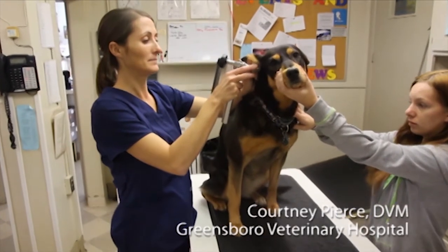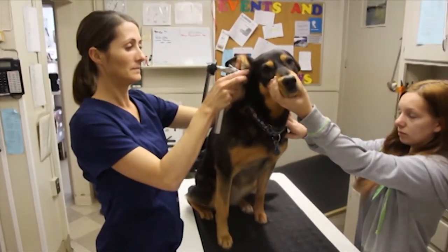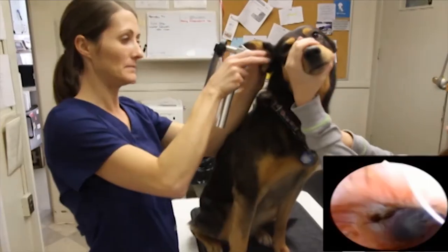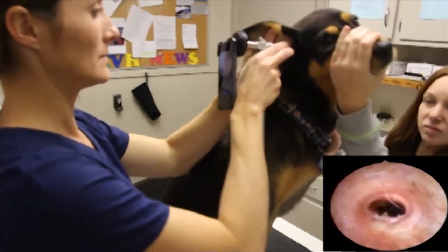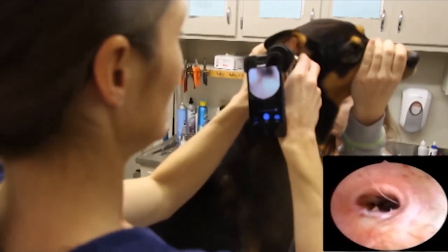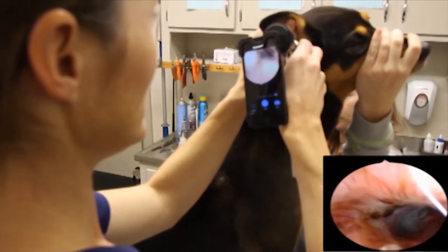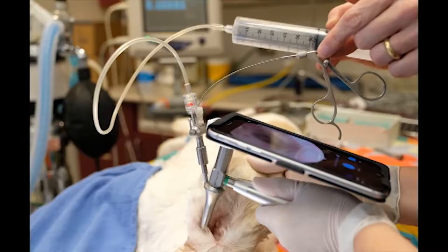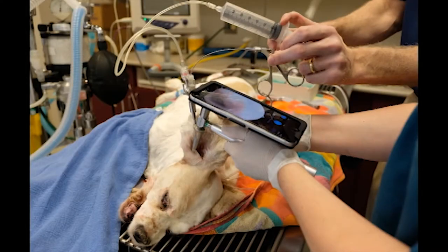Many veterinarians feel that they get a better, safer exam using the Video Scope. No longer is your face up against a dog's ear that might already be inflamed. With this scope, you can view the tympanic membrane.